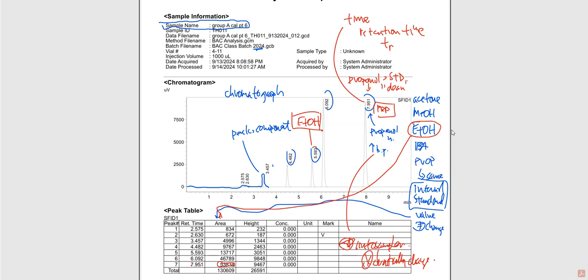So we have to go through the process of how all this math is going to work out. There's tons of numbers and you're like, oh my God, I don't know what to do. Well, there's all kinds of areas on this, absolutely. But for the video's sake, we are going to focus on ethanol only, and that's 5.59, which is right here.